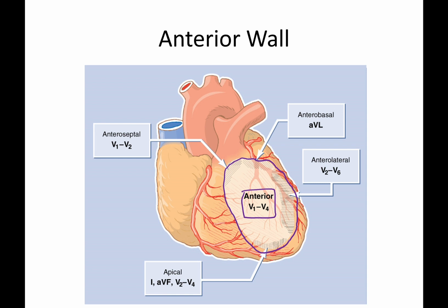At the bottom, you've got apical, because remember this is the apex. And if this is the apex, of course, this is the base at this end, because for whatever reason they decided that the heart was an upside down triangle. Anyhow, here at the bottom, what looks at that bottommost portion of the heart?